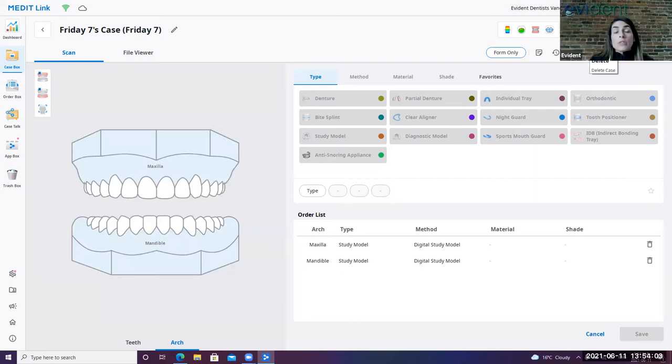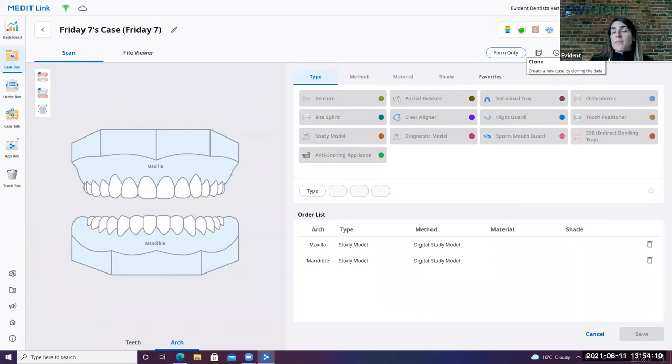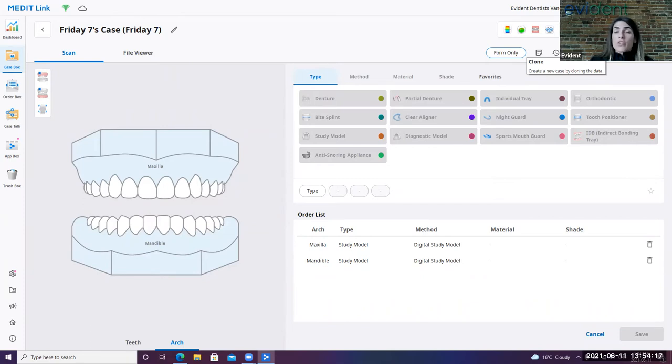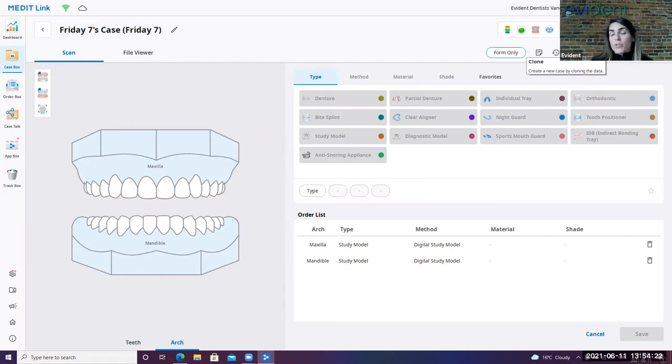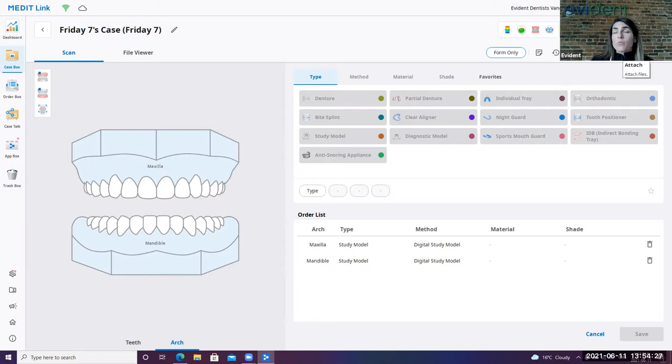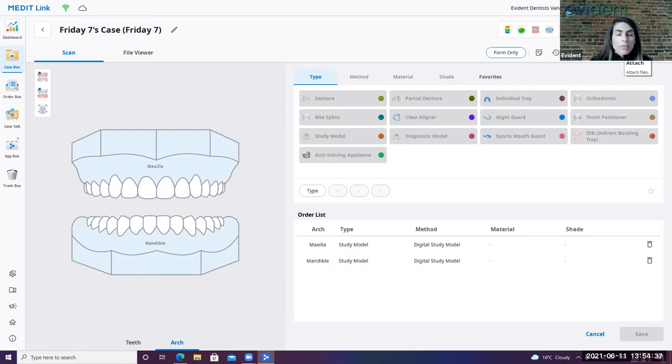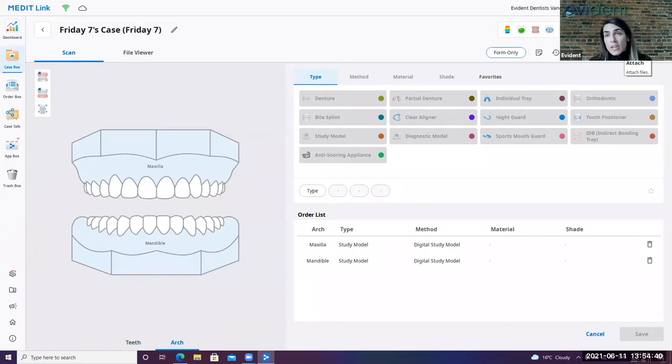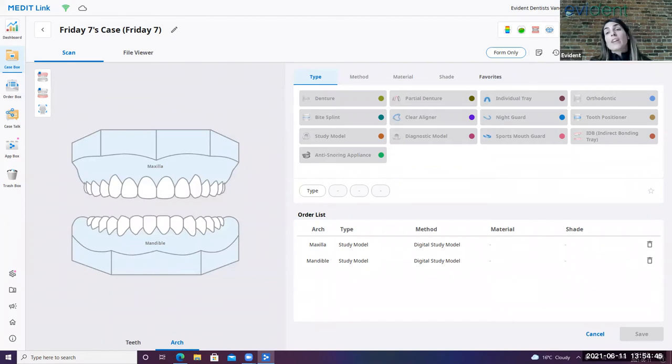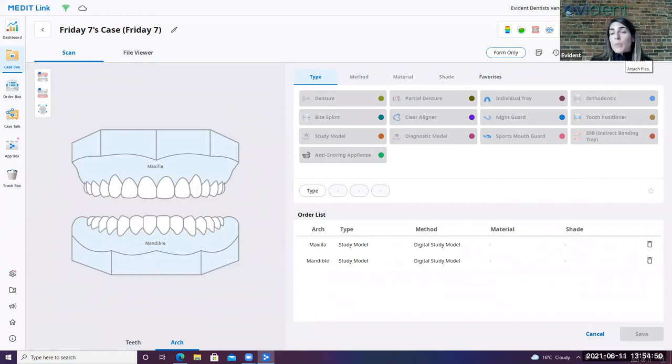If you need to delete your case, for example, if you created it in error, you can go ahead and delete the case here. You can clone the case as well. This is especially important once the case has been ordered and sent to your laboratory, you are unable to modify that scan. So if there are any changes that need to be made, then that will be done by cloning the file. And again, we go through that in detail in our training regiment. There's a section here as well to attach files. This is wonderful if you're dealing with a lab that is fully digital, and you're wanting to ensure that you are able to send digital photography, or any kind of other files that you may want, rather than the lab receiving a digital scan through the Medit link. And then with their driver or through the mail, they're receiving manual photos, you can actually attach all of this to your scan so that they're able to get it in one cohesive location, which can streamline communication.